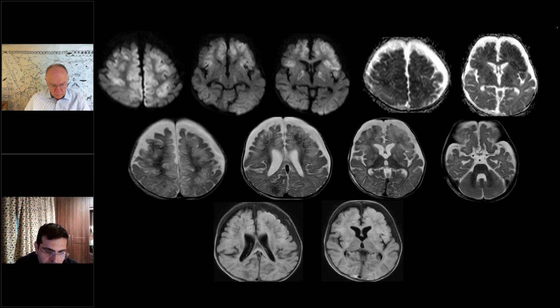Yeah, it is a diving reflex activated. It's a very likely hypoxic event, but I just wanted to ask about any differential timings of different structures going into pseudo-normalization. Yeah, it's just the timing of the scan. It's 2 weeks, so you're kind of borderline, going to start resolving all these diffusion changes. Any longer, I think you would just pick up atrophy and leukomalacia.